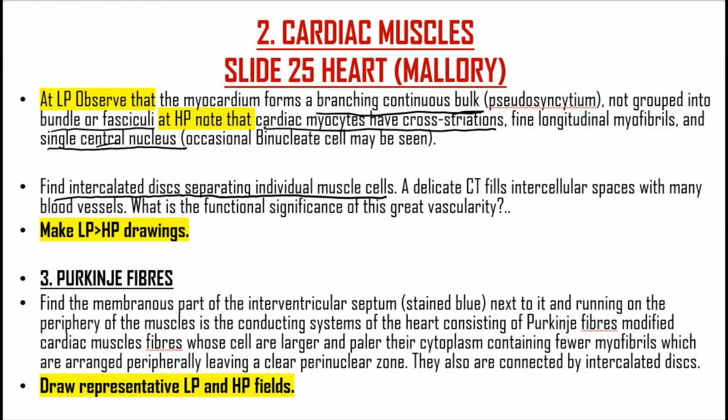And you also note the connective tissue that the cardiac muscle has. Very important. So you make the drawing at low power and at high power. And you also note the Purkinje fibers.